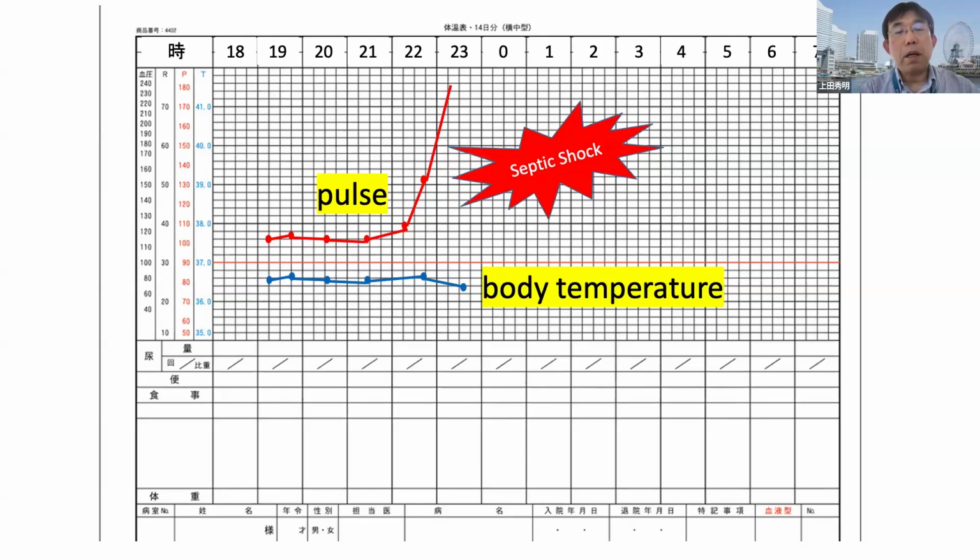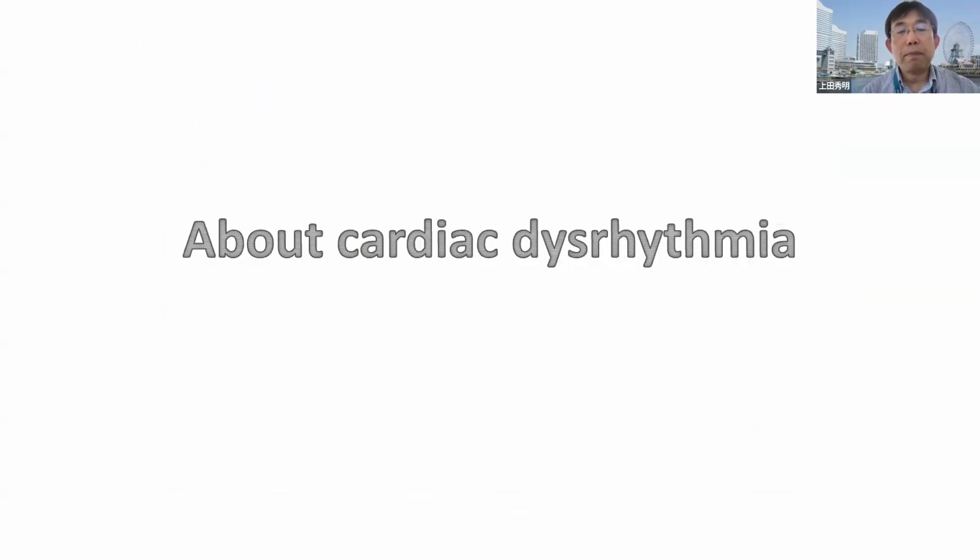So sometimes the pulse moves very quickly without any high temperature. But whenever we see a high rate of tachycardia, we always think about the possibility of septic shock.